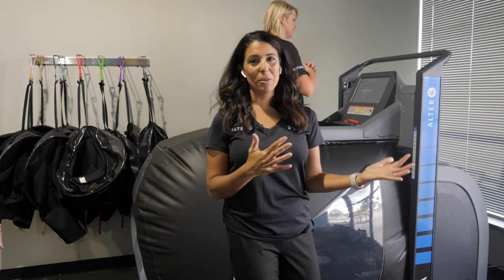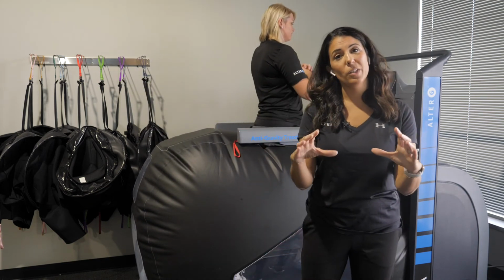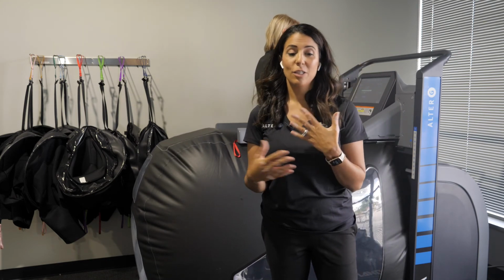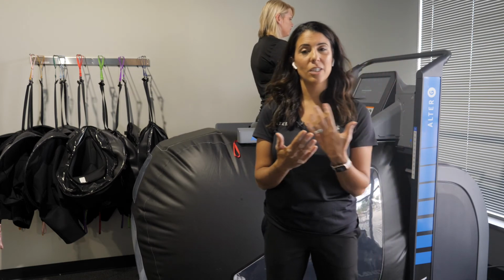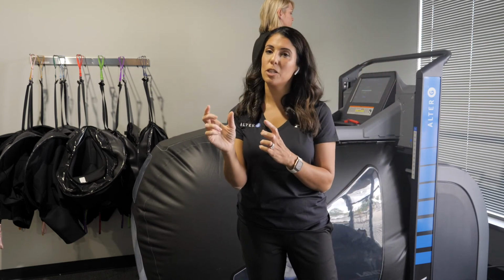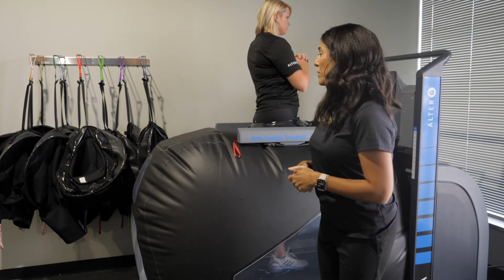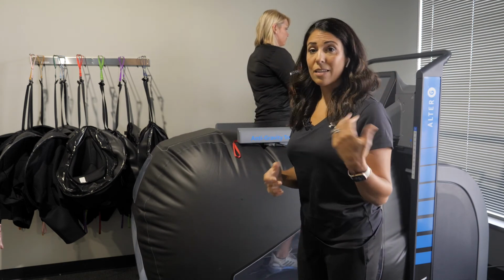Just a simple lateral weight shift. Maybe it's utilizing the StrideSmart software to look at the percentage of weight left versus right, so that the individual, again, the patient can see the percentage increase when they truly shift their weight onto their right leg versus their left. You could do a lot of single leg stance.